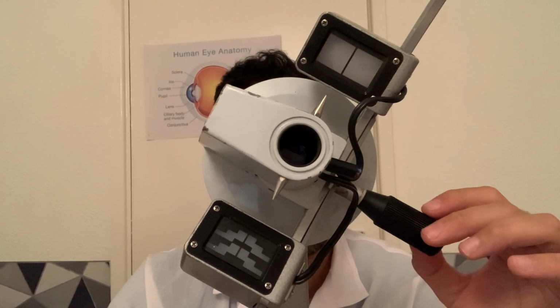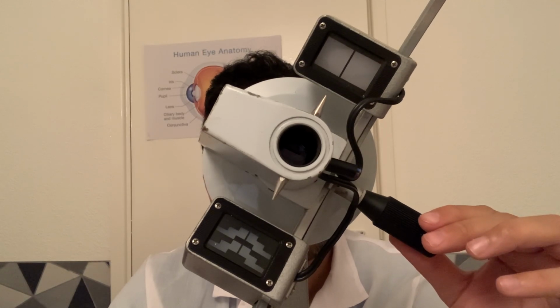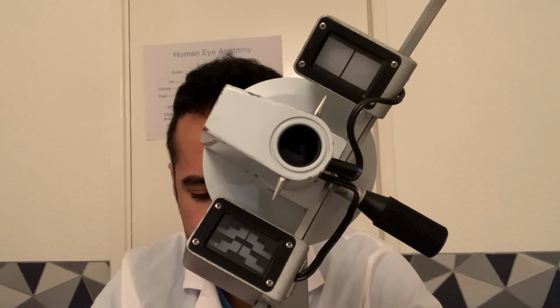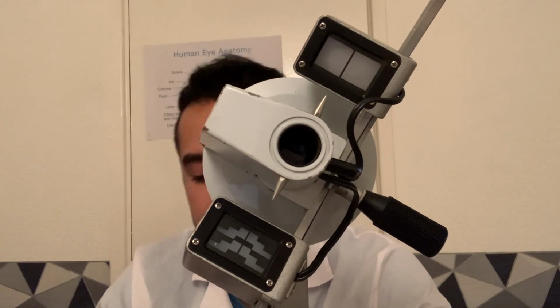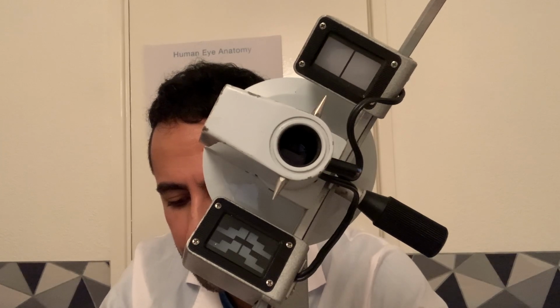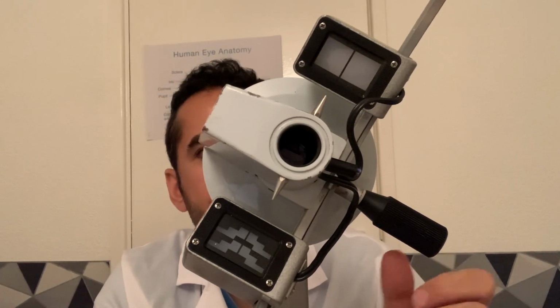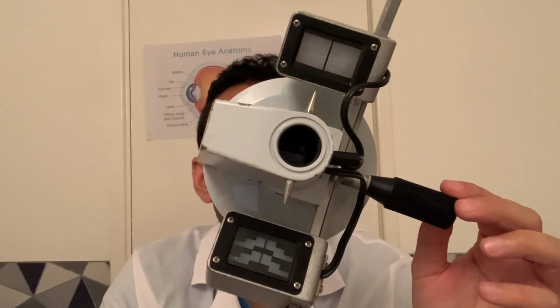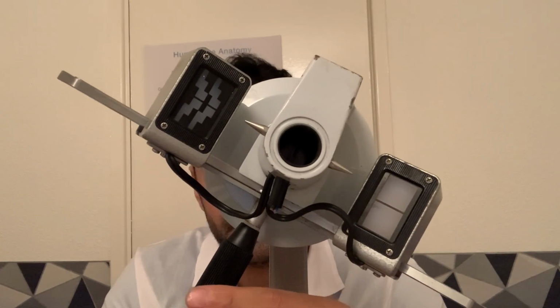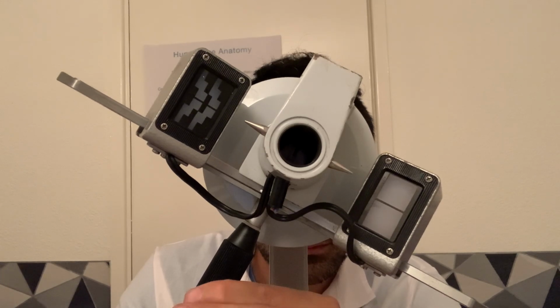I'll have a look at the scale. Okay, so we're looking at possibly 8.8 millimeters at 120 degrees. So that is the curvature of the cornea. 120. So 90 degrees to that, I'll go to 30. There we go. So 30 degrees to the initial reading. Let's have a look what the curvature is there.